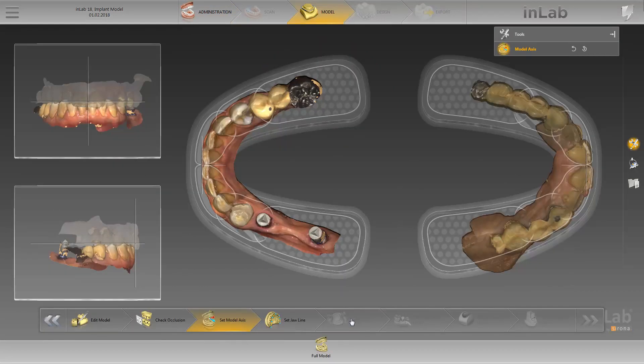The first step in this phase is to set the model axis. We'll follow the recommended standard procedure and align the 3D model optimally in the occlusal, buccal, and mesial views. Then we move to the next step, set jawline.